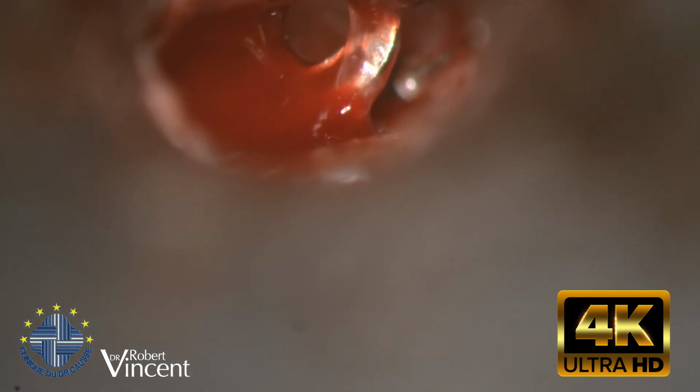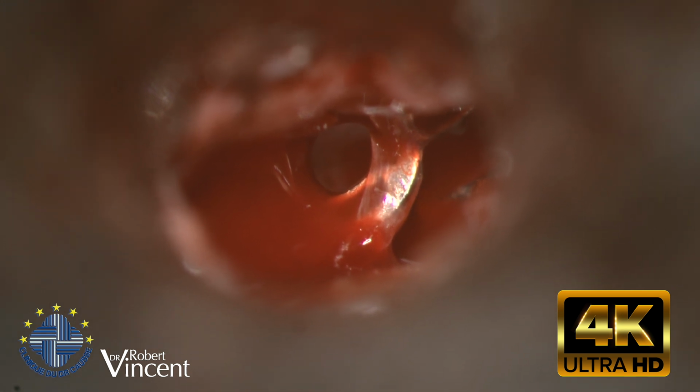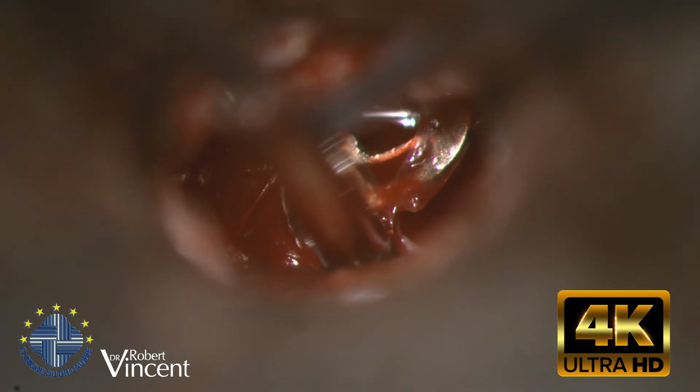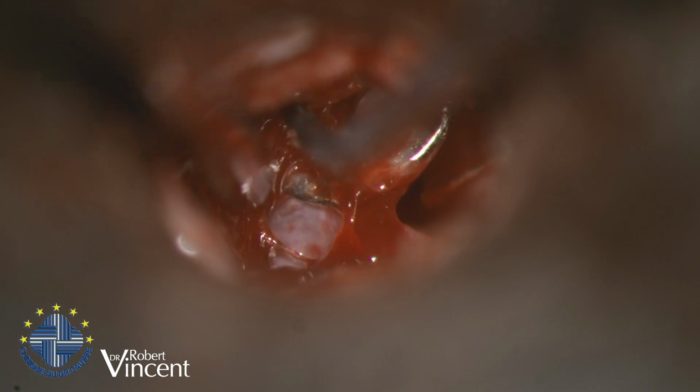This is a right revision tympanoplasty, transcanal approach, in a very narrow canal, because you are using a 5 millimeter diameter speculum. I drilled the canal anteriorly. The problem here is to see the different landmarks.